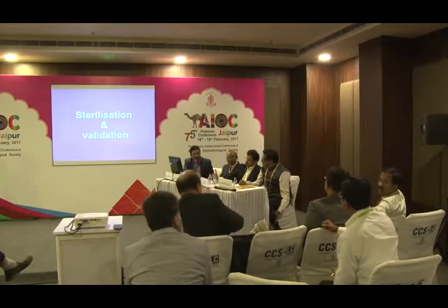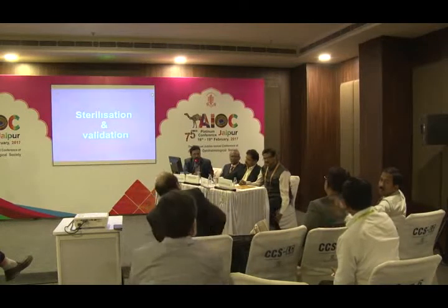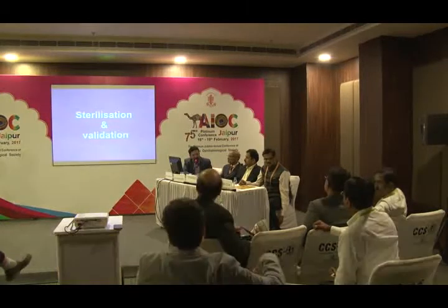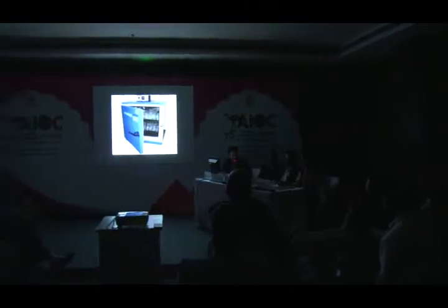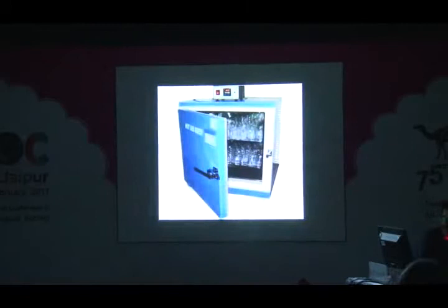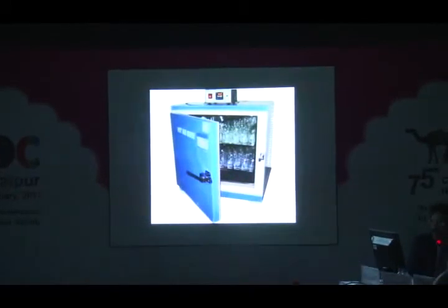It's better not to use hot air. First of all, if you are cleaning outside, you then need to worry about the particulate matter and this aerosol matter. At 230 degrees temperature, even metals will start melting, and it will distort your instruments.